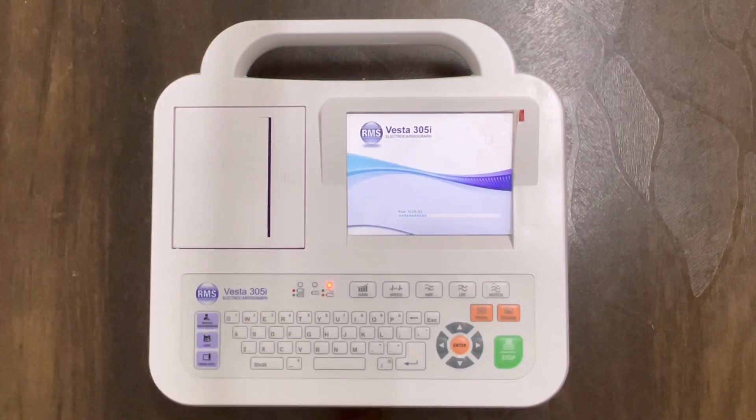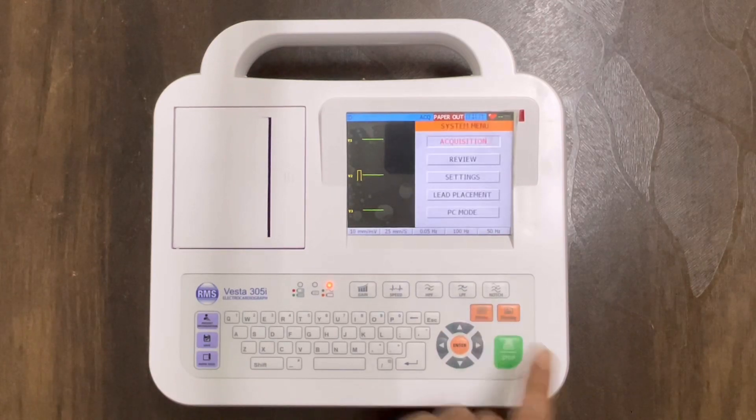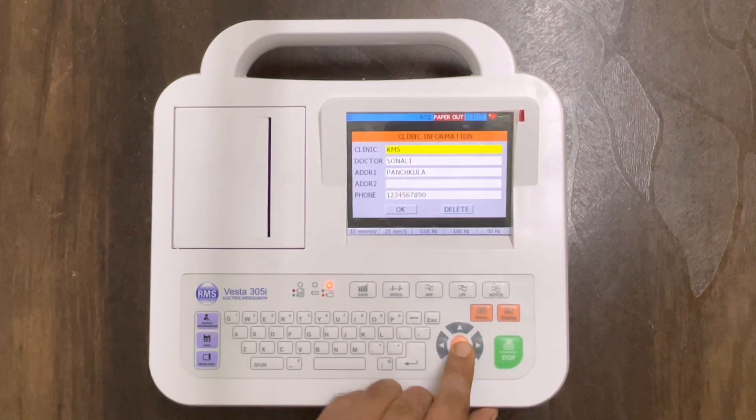Tighten the screw properly with the help of a screwdriver. After fixing the fuse, now let us switch on the machine. After the machine turns on, the first thing we need to do is add the clinic information. For that, click on the menu button, then settings, then go to clinic information and press enter.